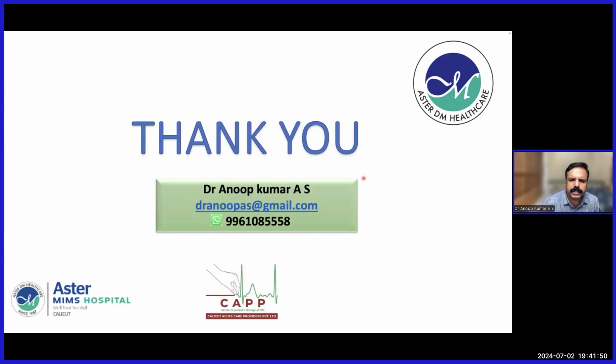The same way you can use the NIV in a cardiogenic pulmonary edema or in a type 1 respiratory failure. There, the main difference is you give more EPAP. When you give more EPAP, because of the reduction in the transmural pressure, the afterload will be reduced. Because of the increase in the thoracic pressure, the filling will be reduced, or the preload also will be impaired. So that is how you can use it in the cardiogenic pulmonary edema.